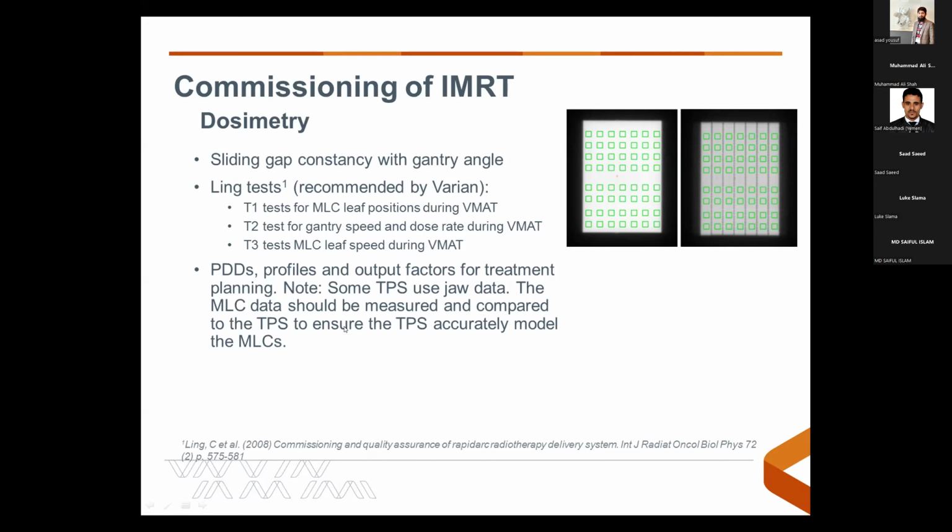T2 tests for gantry speed and dose rate during VMAT delivery, and T3 test for MLC leaf speed during VMAT delivery. So these are some example images, and these are taken from the analysis software we use. It's an in-house software we made. And this is the Ling test.